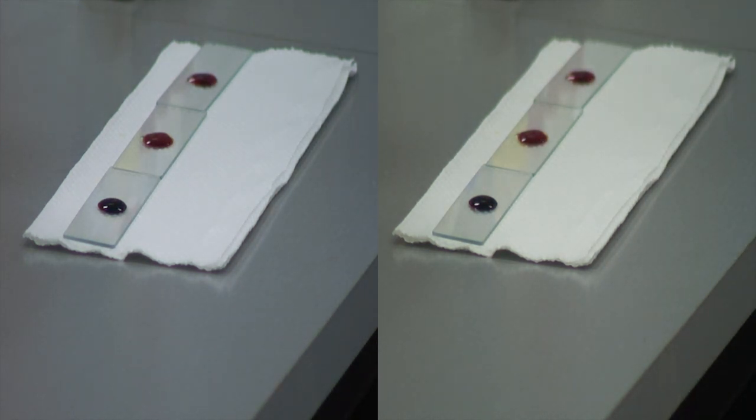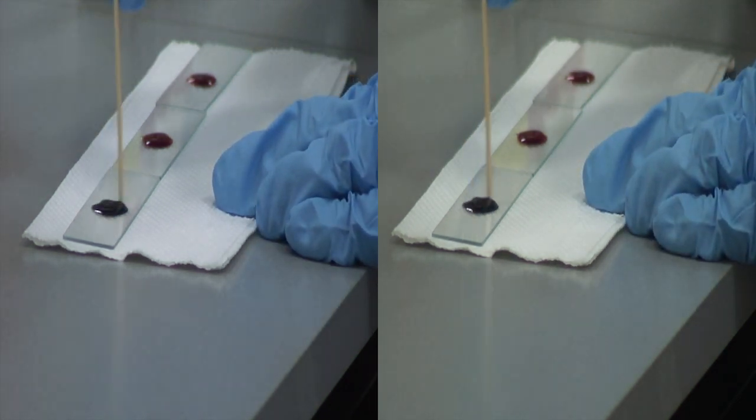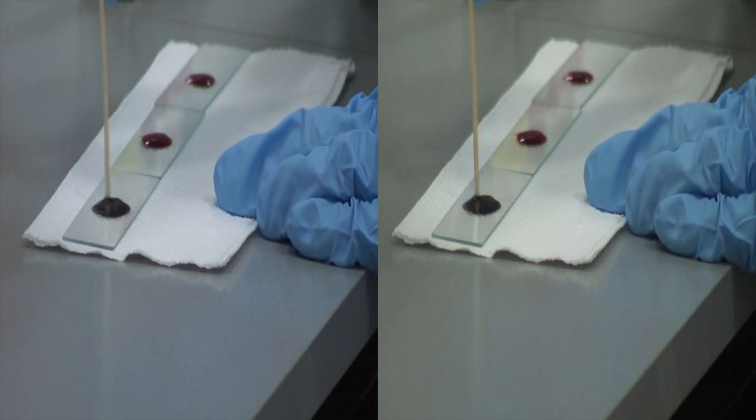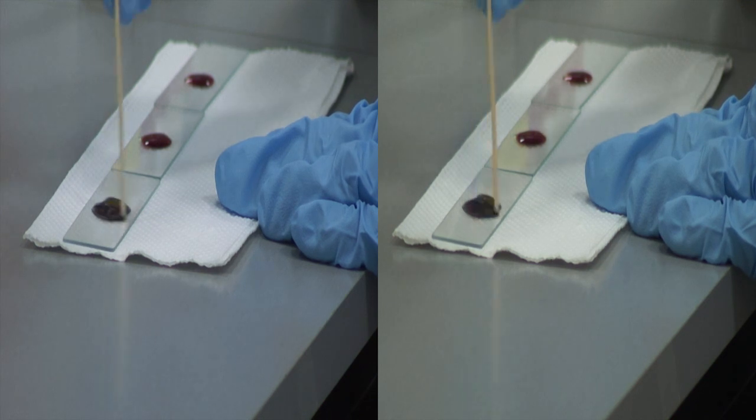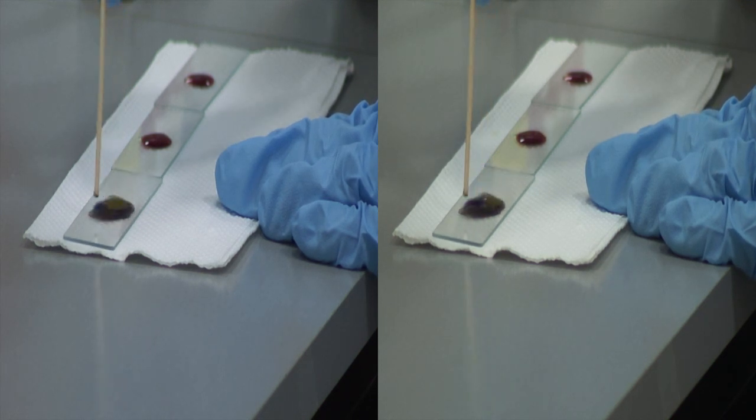Blood is left to incubate for around a minute on the glass slide to allow for agglutination. Agglutination is the irregular clumping of antigen and antibody.